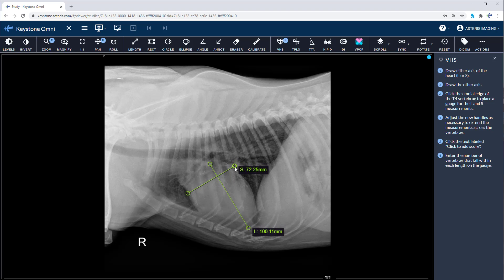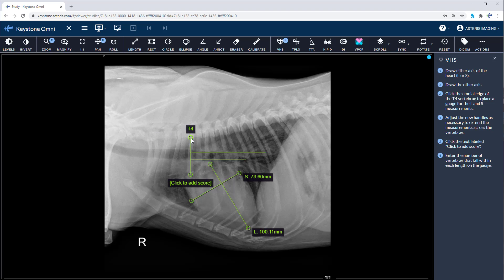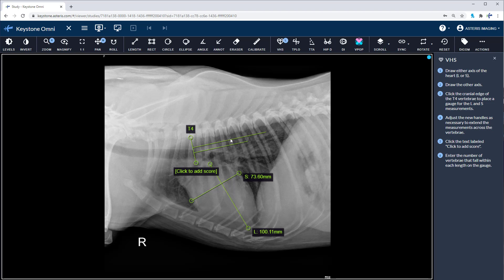Make any adjustments after you place your long and short axis measurements. Next, place your marker at the cranial edge of T4. Line up the long and short axis with the spine to get an accurate measurement of how many vertebrae are within the long and short axis measurements.